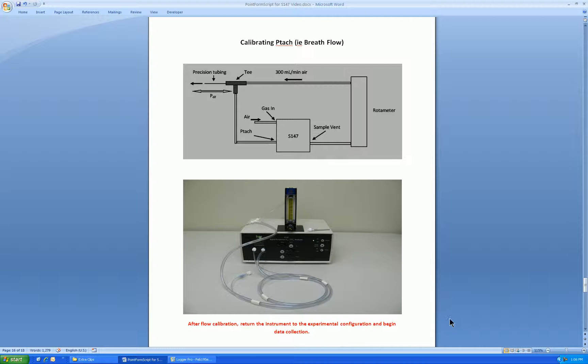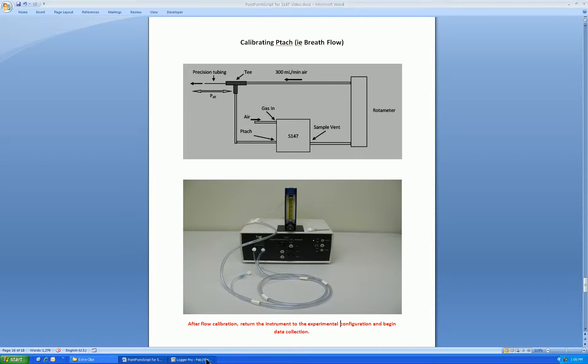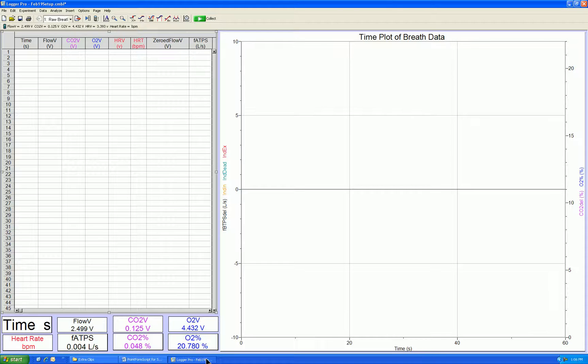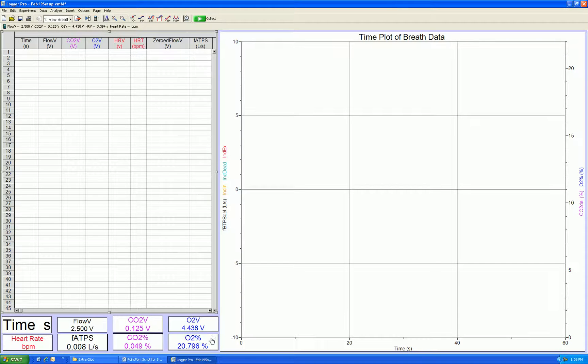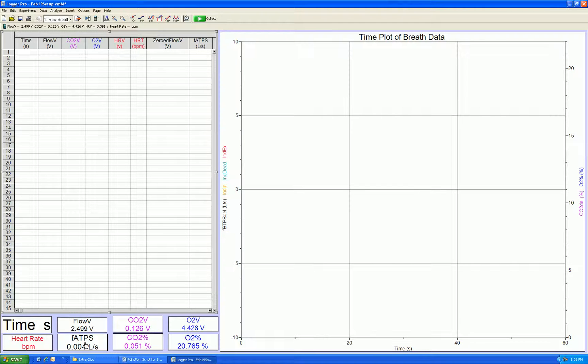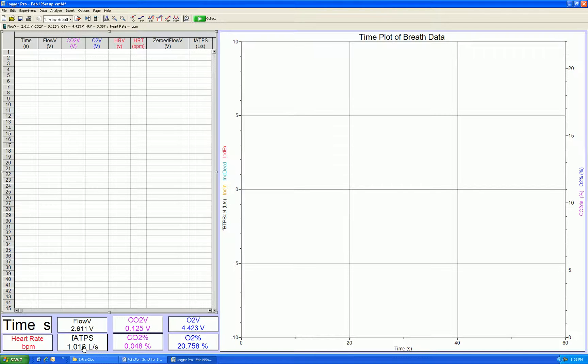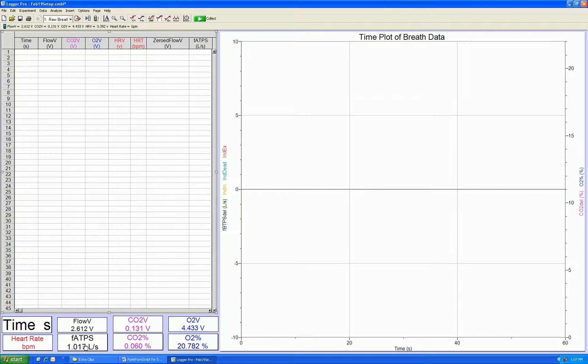So let's actually see the calibration procedure on the Logger Pro screen. I now have no flow through the PTAC, therefore should have a flow value of 0, which is the case. If this is not the case, adjust the 0 of the PTAC on the front of the S147 to obtain a flow of 0. Next, I will change over to the large bore tubing, according to the setup in the previous slide, and you see we obtain a flow value of about 1 liter per second. If this is not the case, adjust the PTAC span on the front of the S147 to obtain 1 liter per second.